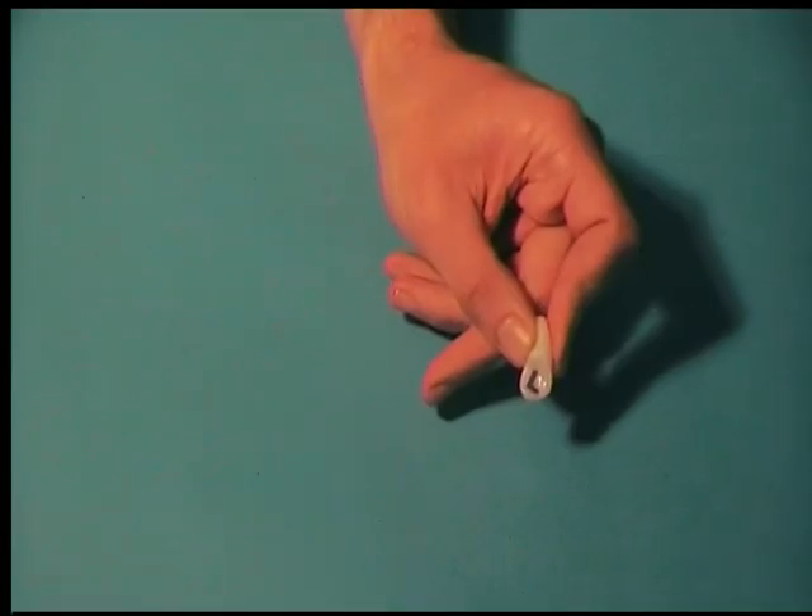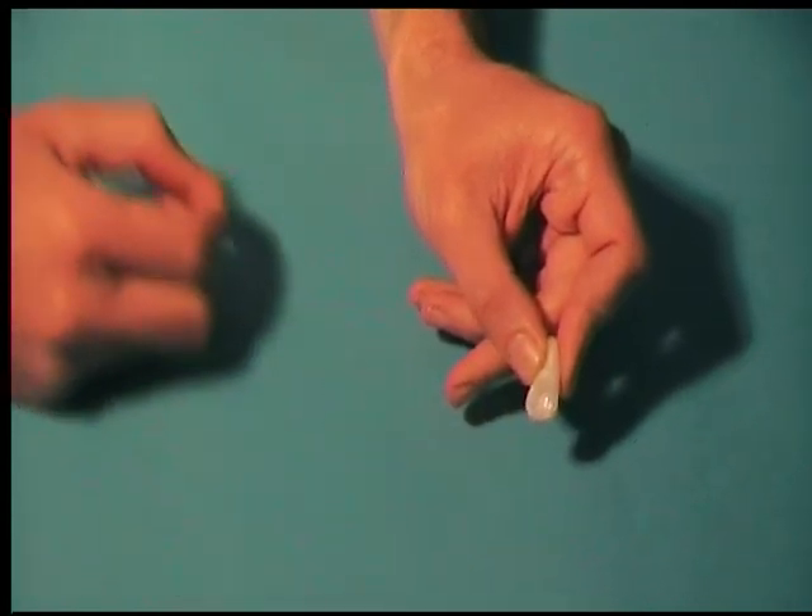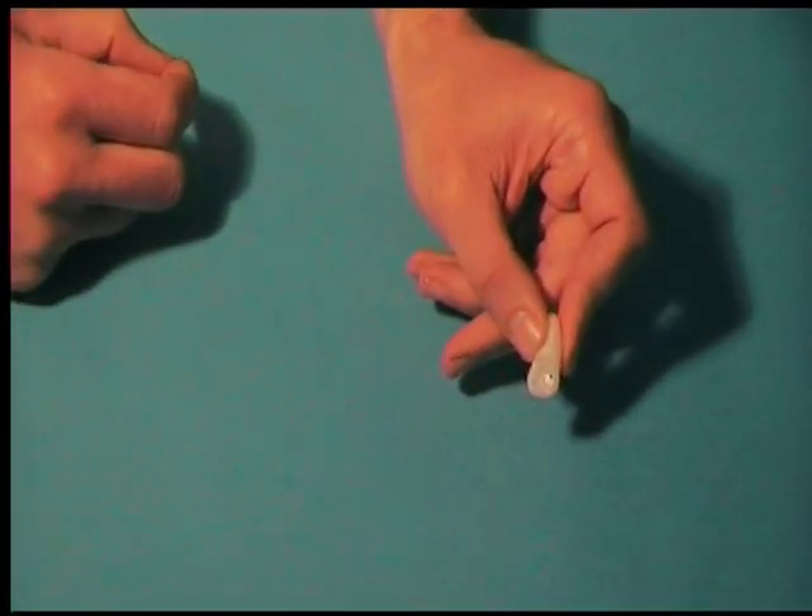Remove the letter from the earplug, rewind the film and repeat the same process on the other side, but leaving the handle blank without the plastic letter L. Leave each earplug in the cold water for about a minute before removing it.